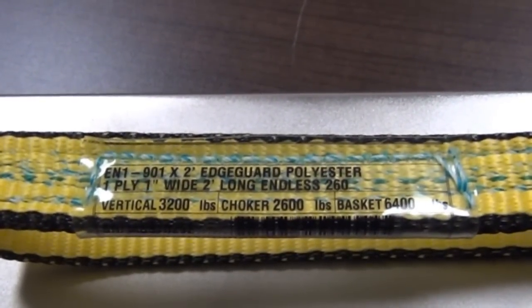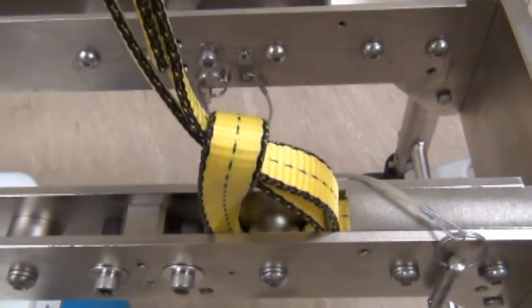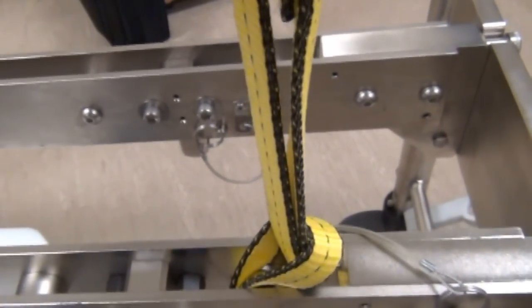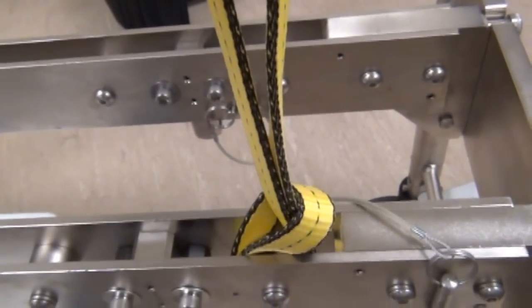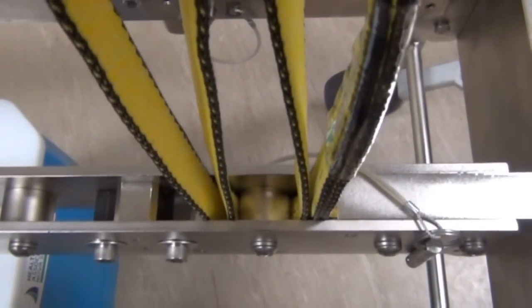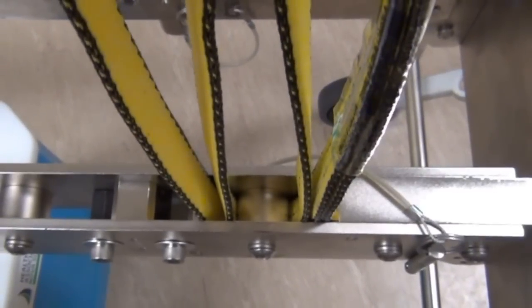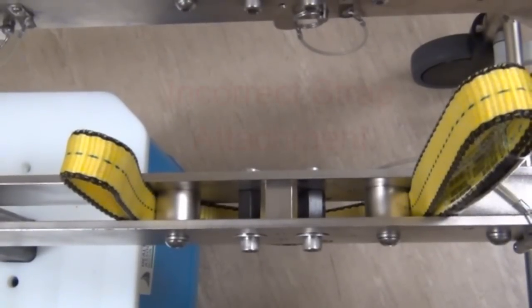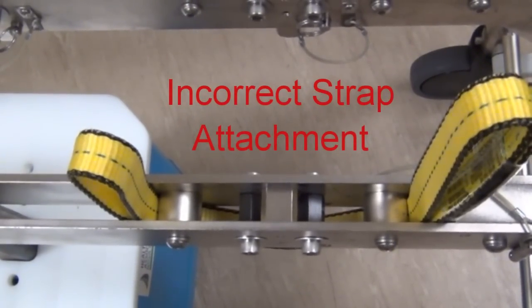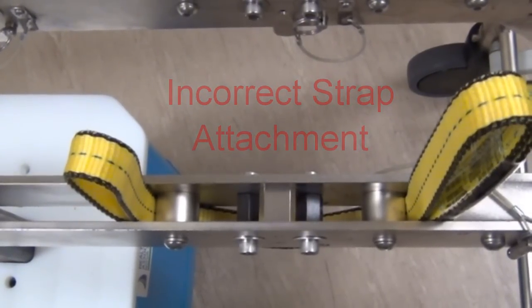Straps can be attached to the lift load in two manners: looped or choker wrapped. It is important to note the load limit for the strap in each configuration. Shown first is the choker wrapping method — one end of the strap is passed through the load beam around the loading pin and fed back through the strap again. The loop method is performed by passing the strap through the load beam underneath the loading pin and using both ends of the strap to attach the lift load to the patient lift. An incorrect use of the loading straps is also shown — each strap is to be wrapped around one supporting pin only. Do not loop the strap around multiple pins, load beams, or end frames.